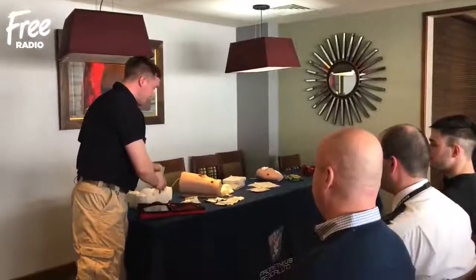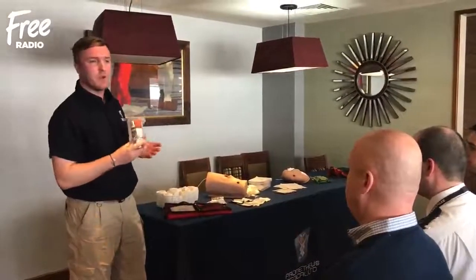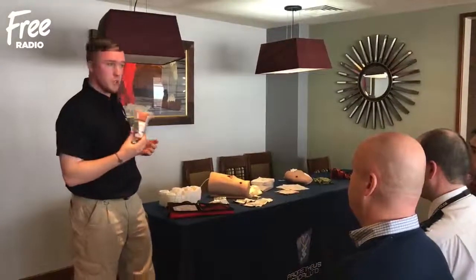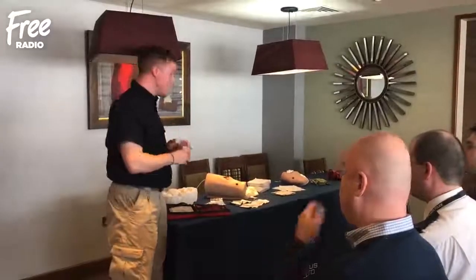And then the kit itself, we've got a few things. We've got a tourniquet which is going to be for arterial limb bleeds. So if we've got a major hemorrhage from a limb, we're going to pop on a tourniquet. And this is the Soft-T tactical tourniquet.